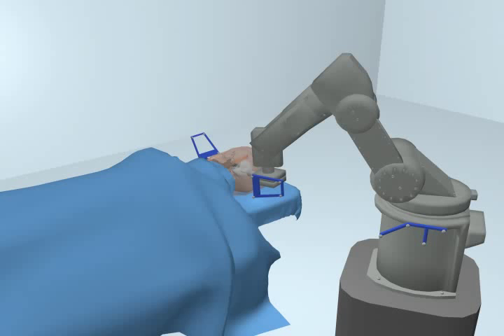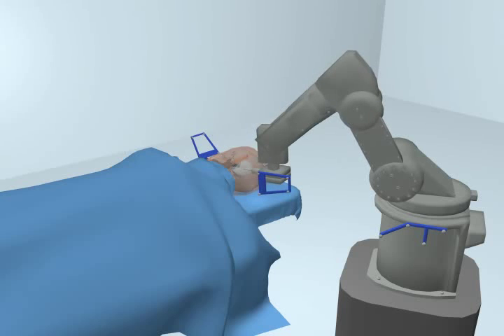Once milling or excavation of the bone is completed, the robot is moved away from the patient. The theoretical advantages of having a robot perform this procedure are to improve accuracy and efficiency.